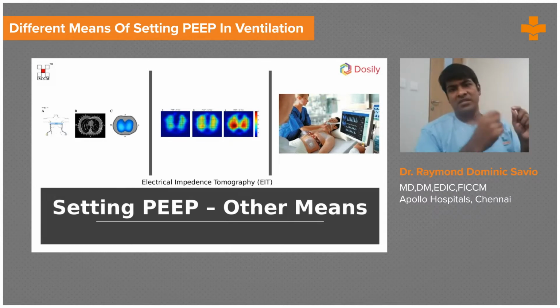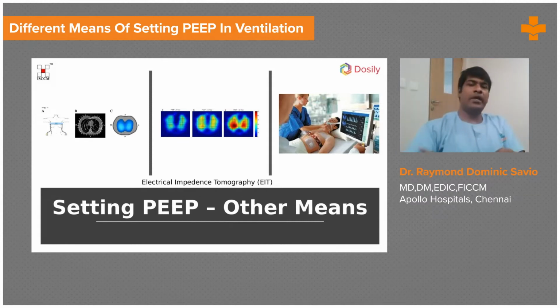This resistance varies depending on whether the alveolar septa are relaxed or stretched. When they are relaxed, they are good conductors of electricity. When they are stretched, they are poor conductors of electricity. So we have a color coding system. Again, I'm not able to show you because I don't have the cursor, I'm sorry. We know certain colors represent over distension. You can see in the middle image that with increasing PEEP, brown areas start appearing. Brown areas show over distension. Somewhere between green and blue is where normally aerated lungs are. Let me not dwell too much over here.